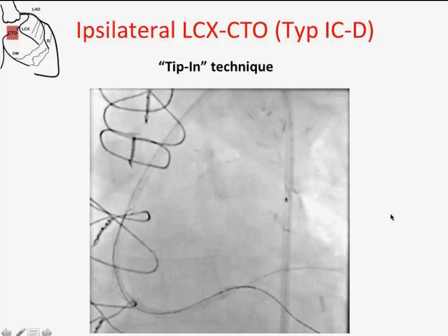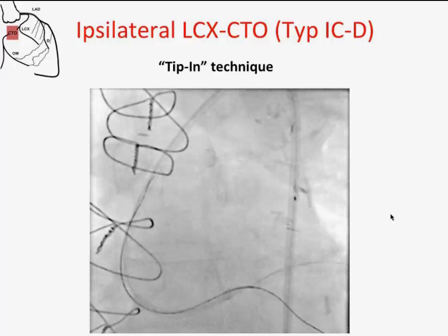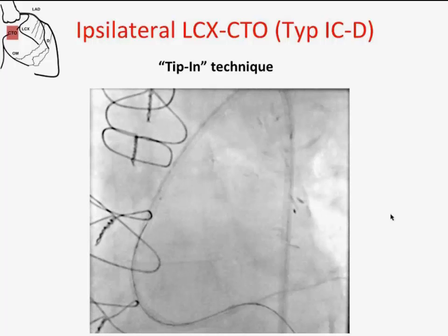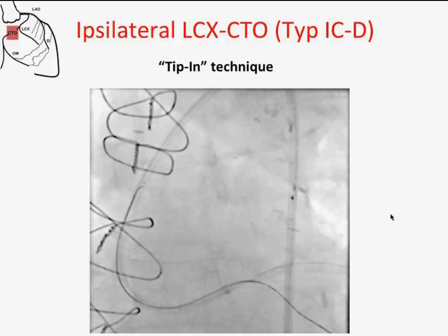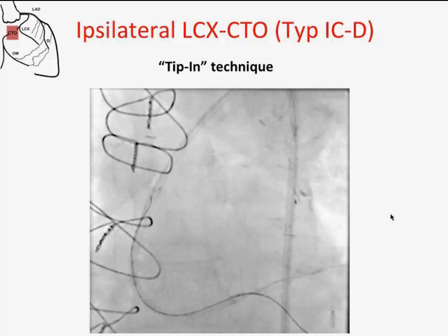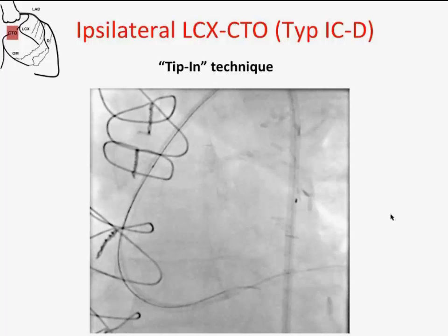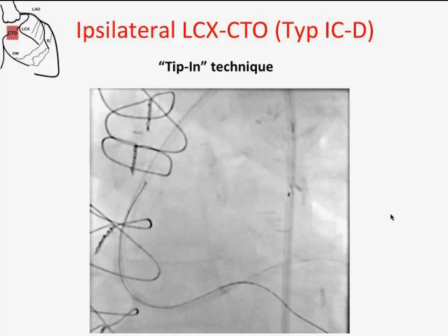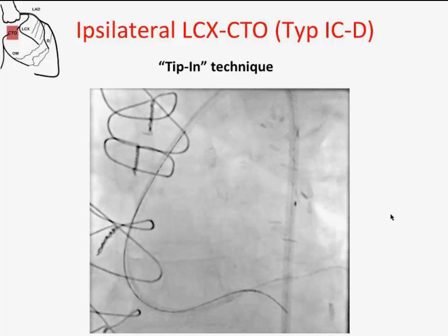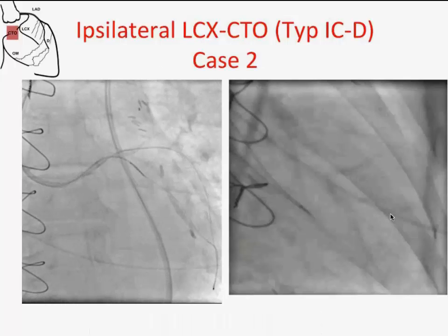So the question is, why am I doing this? As you've seen, this connection which I passed is very thin. So what I try to avoid is stenting and balloon dilatation and working with stents with this internal coronary loop, because I believe that when you get friction or tension on the loop, which we all remember from our first retrograde cases, where we sometimes had strangulation of the heart because we didn't realize this. But when this happens in epicardials, it can rupture. This is the shear stress I'm talking about all the time, and then it can rupture.